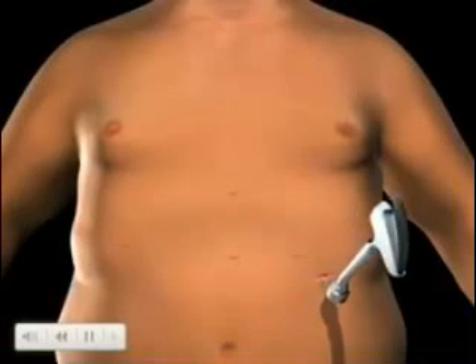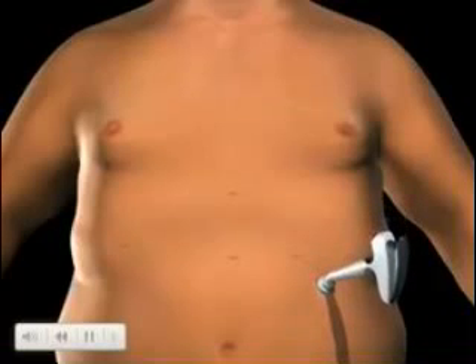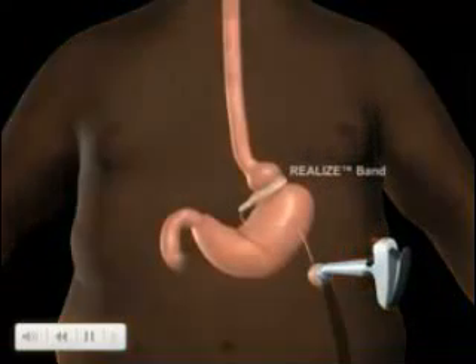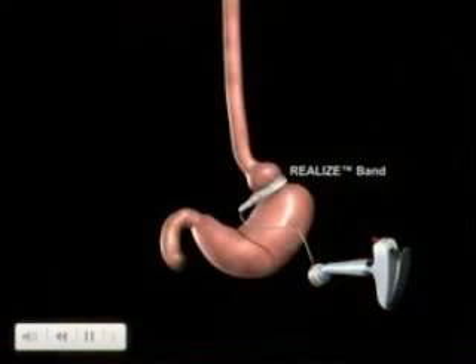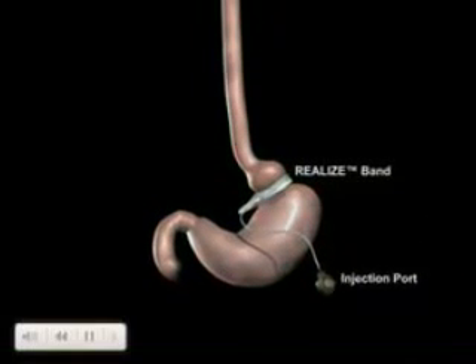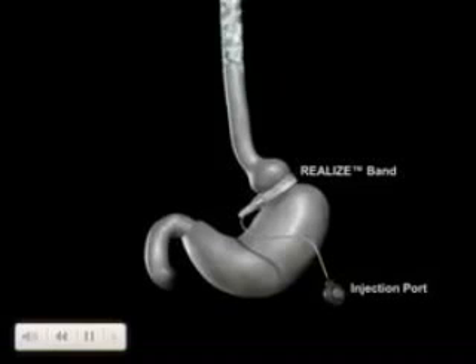The tube is secured using the locking connector on the port, and the injection port and tube are placed beneath the skin. The REALIZE band does not alter your digestive function. Food consumed passes through the digestive tract in the normal route.